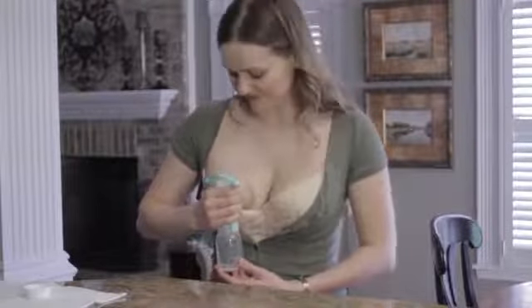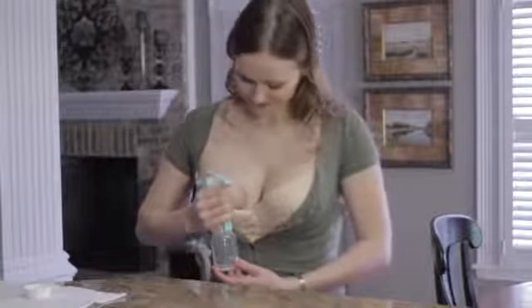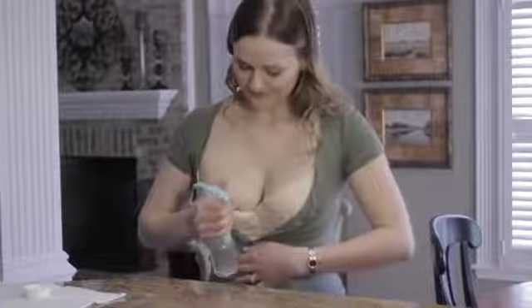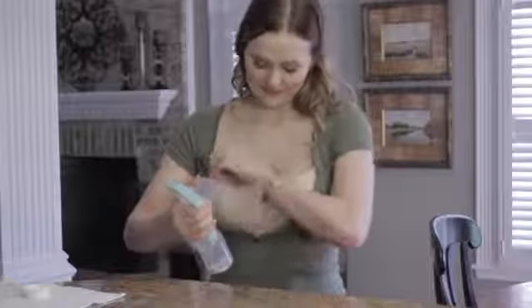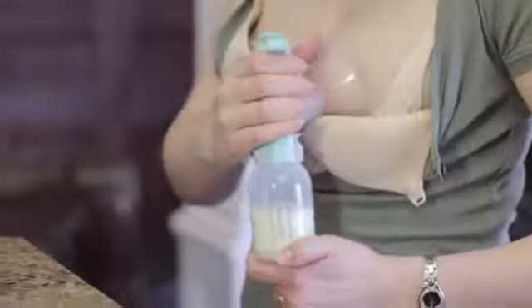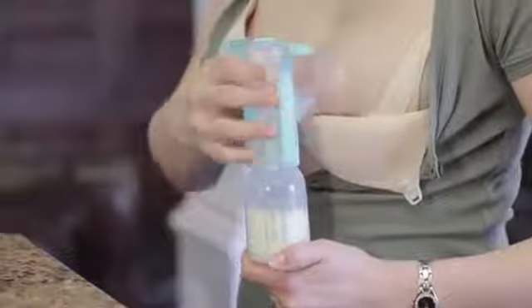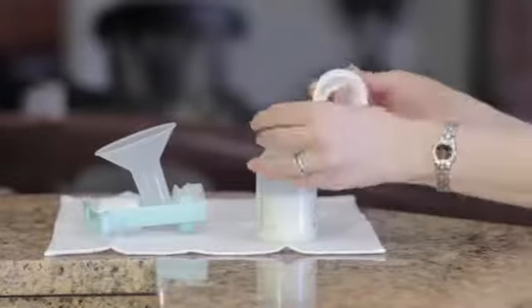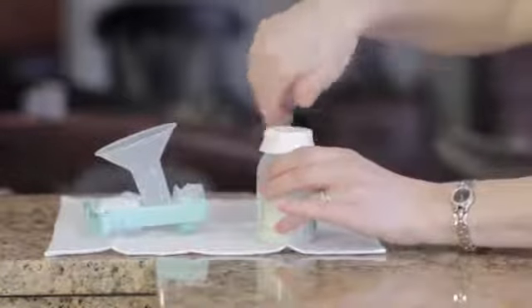With the one-hand breast pump, each pumping session should take about 20 to 30 minutes, and it's a good idea to switch breasts about every 5 to 7 minutes. When you have finished pumping, simply remove the pump from your breast. Unscrew the collection bottle and screw the locking caps into place. Follow the milk storage guidelines you were given.